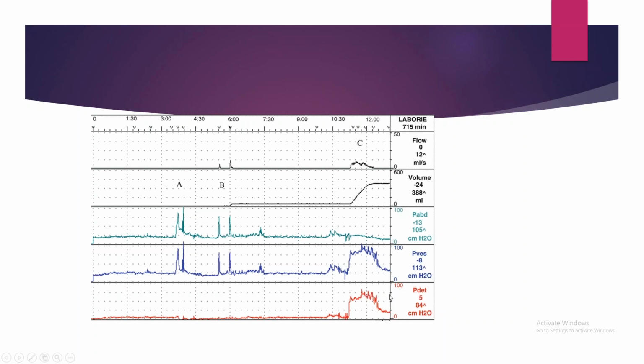It is from 70 to 75 only. So this is normal, okay? So the detrusor pressure rise is normal, but reduced Qmax is there. So here also there can be some external obstruction. Again, the plateau phase is there. The bell shape is not normal. It is plateaued, okay? So here also there can be some obstruction. Got it?